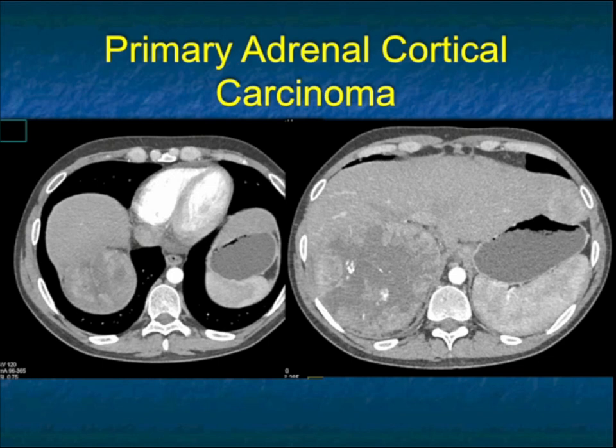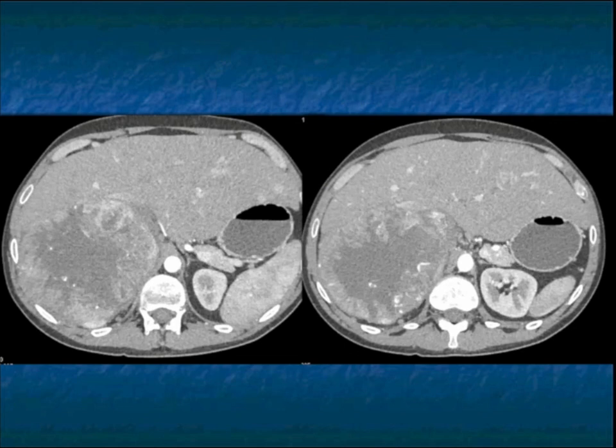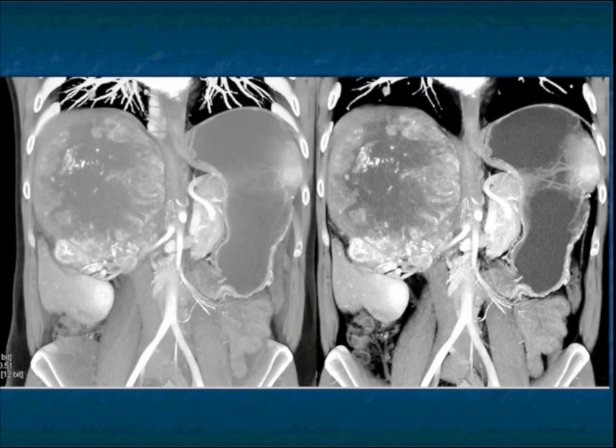At times when you look at this image, only at this image, it looks like maybe this is a primary liver lesion like a hepatoma. Hepatomas can be well defined with pseudocapsule, but this is adrenal lesion, as I'll show you. You see the necrosis, you see the large size, you see the central calcifications, you see the mottled enhancement, you see some nodes more medially placed. You can see the tumor is very necrotic.